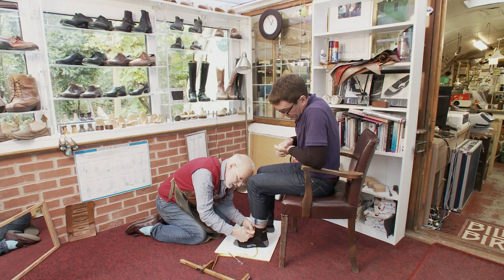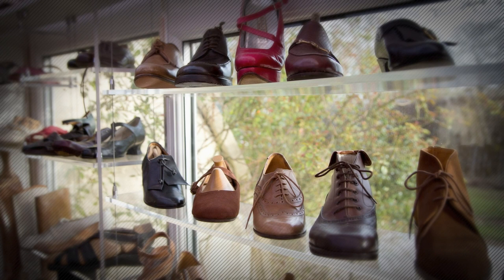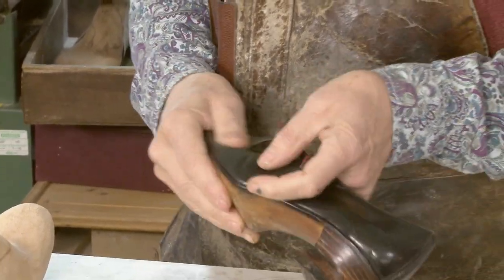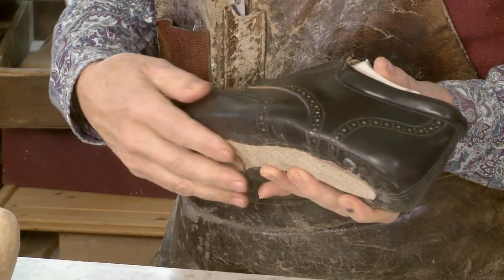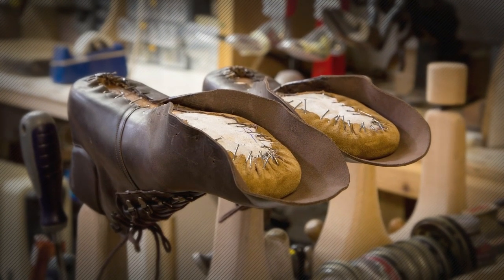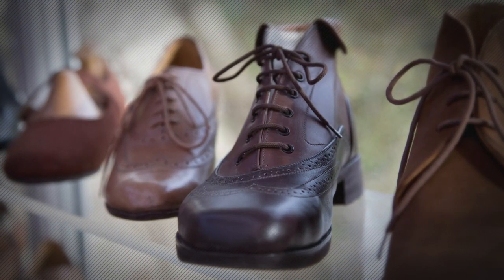It sweeps up and suddenly it climbs the shin — a very distinct point. By making the right decisions at every stage of the shoemaking process, the right style — this is made out of kid, this is made out of a light calf leather, this is made out of cordovan actually, beautifully polished — you not only help them recover their mobility, but just as importantly, their self-worth and self-confidence.